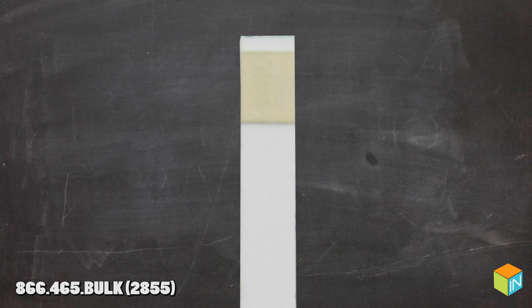Inspect the test pad. The test pad should be a cream color. If the test pad is tan or otherwise discolored, do not use the test.